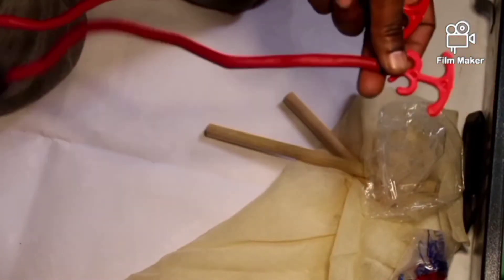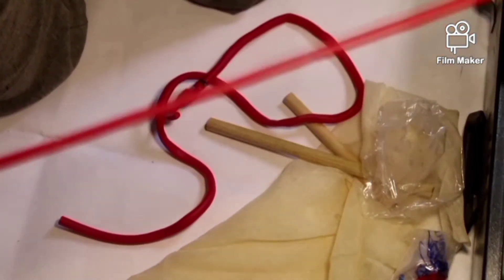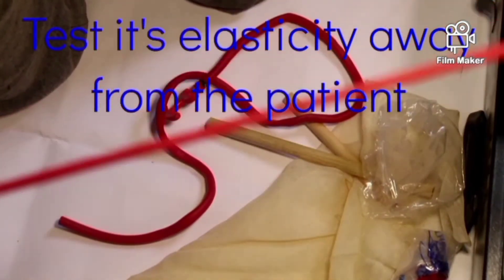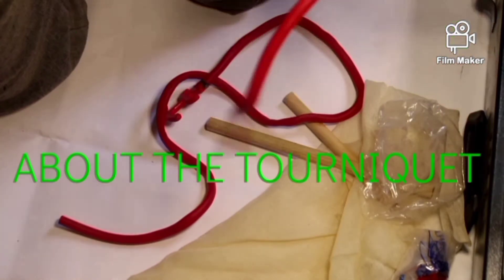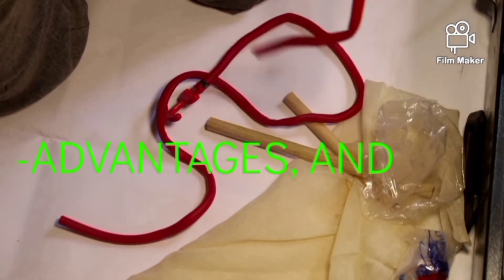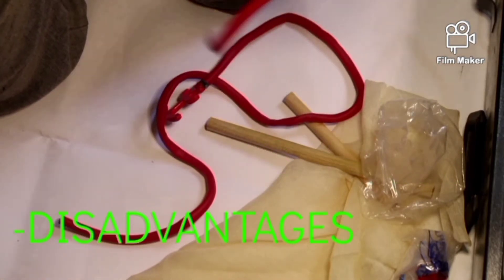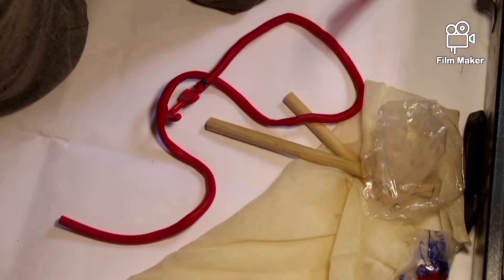We need to test the rubber tourniquet's elasticity away from the patient. There is much to be said about tourniquets — precautions, advantages, and disadvantages — and we shall cover that in another video where we talk more about rubber tourniquets and bandage tourniquets.